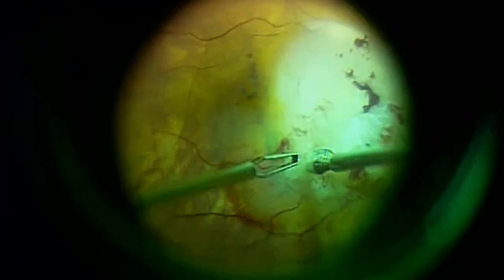The biopsy forceps was then introduced to the subretinal space and the sample from the subretinal component of the lesion was obtained.